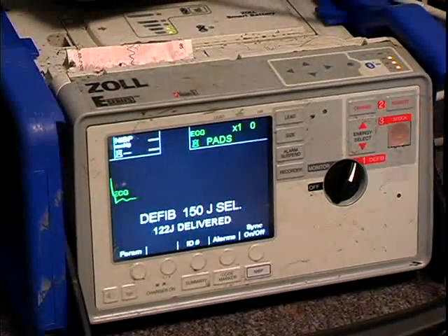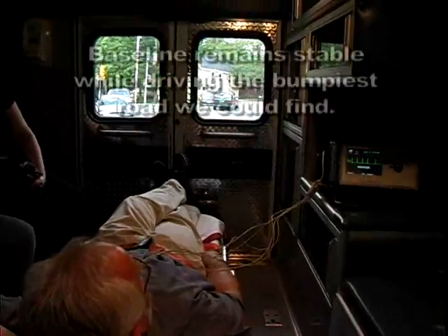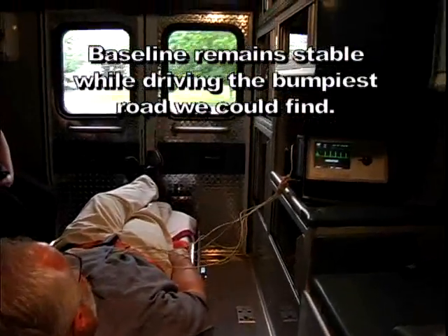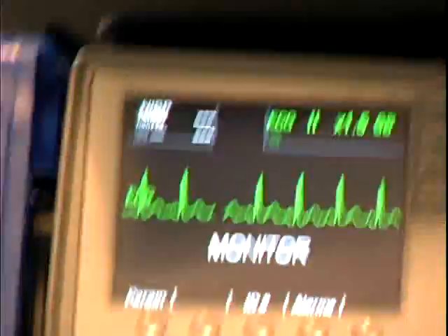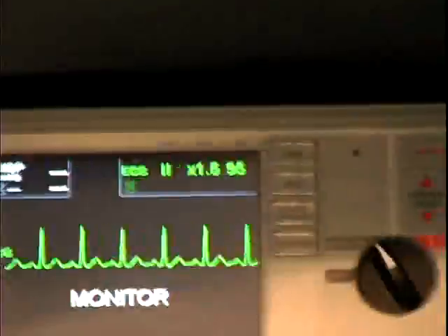We got a check recorder message because the paper was still soaked — we used the same device throughout. Here we are in the back of an ambulance. The device is hooked to me, not to a simulator. We're not trying to shake the camera — that's just how bumpy the road was, and you can see the baseline is just as stable as can be.